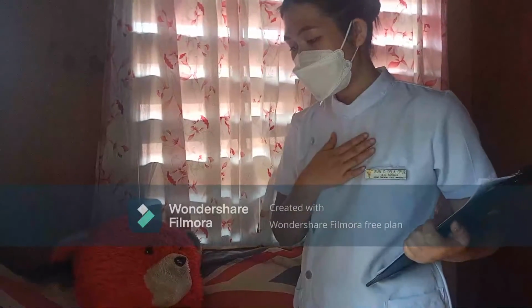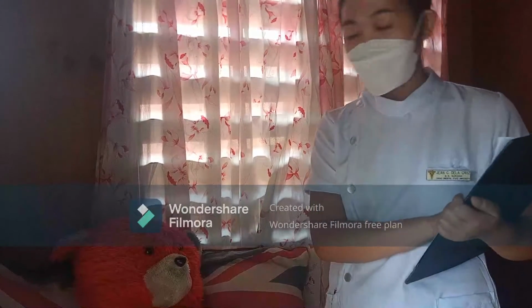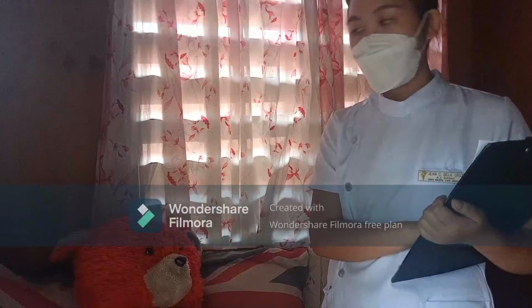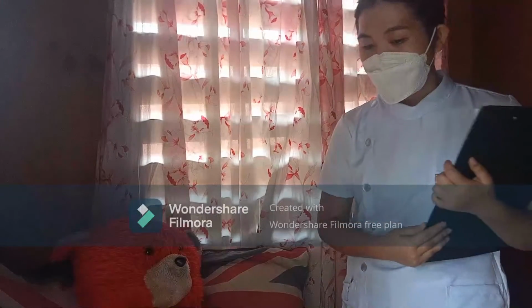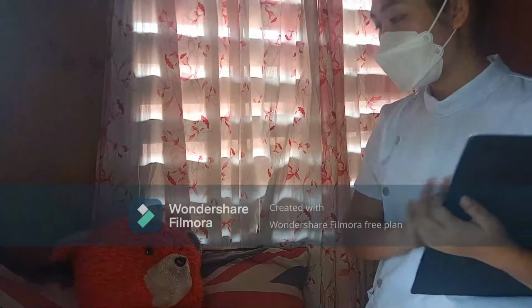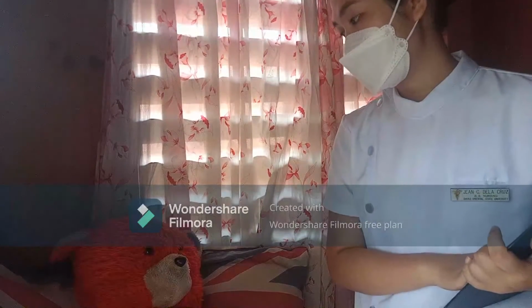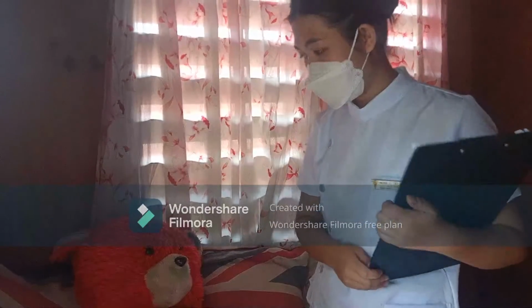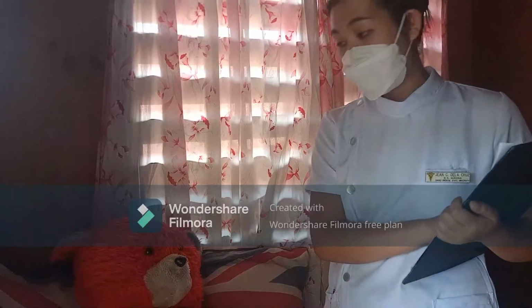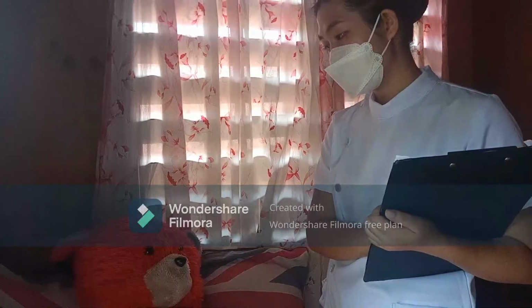In the implementation, first, greet client, introduce yourself, and explain the procedure in the client's level of understanding. Then, identify client using two identifiers, which is the name and the date of birth. Good day, ma'am. I am Dela Cruz, your student nurse for today. May I know your name, ma'am? How about your birthday, ma'am?